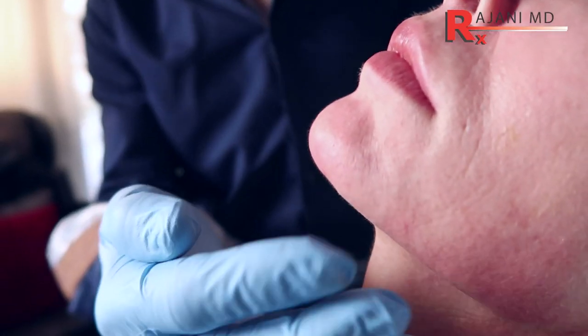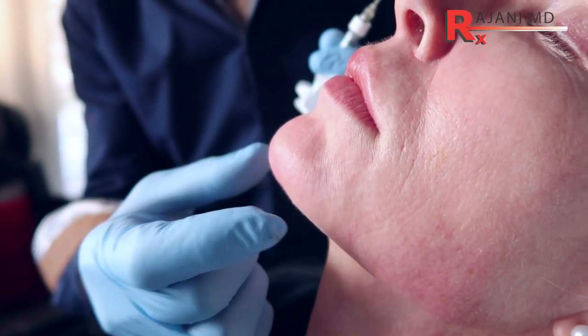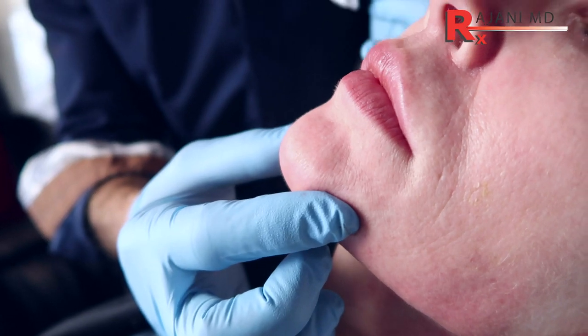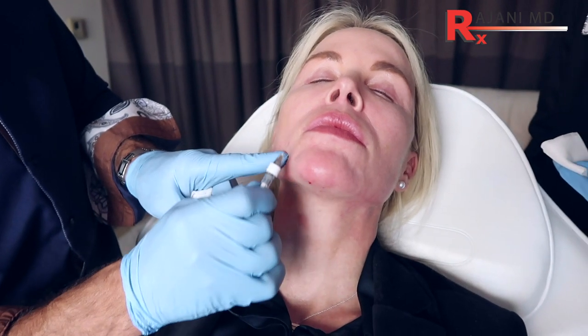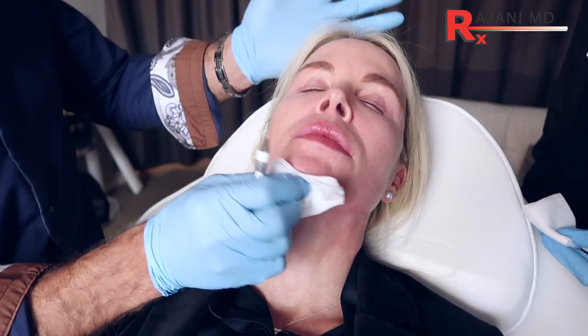But now we have a longer jaw and a little more angle. The other thing: if people have a fat face, this will narrow it a little bit and give the impression of a narrower jaw. And of course, where we struggle with fillers is creating a square lower face, so we can add fillers through here now with a better angle.